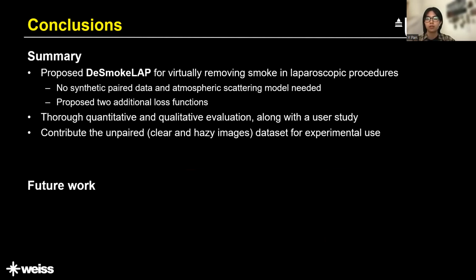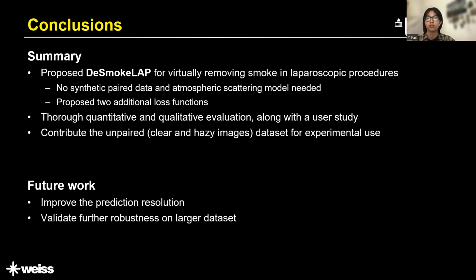For future work, it will include maintaining the original resolution of the laparoscopic video to obtain high-quality desmoked images that will be beneficial for clinical use, and the use of larger datasets for further improving the method's robustness. It is also required to work on reducing the operation time and minimizing the real-time delay in order to be applied in practical operation.